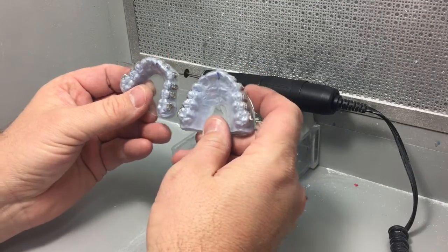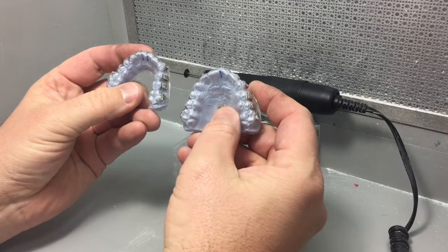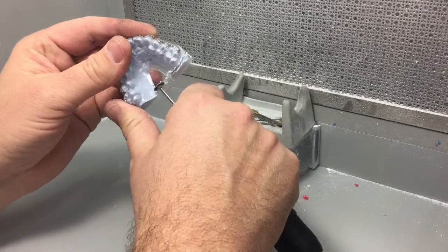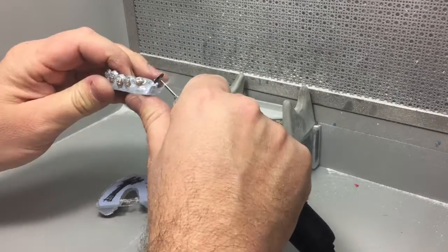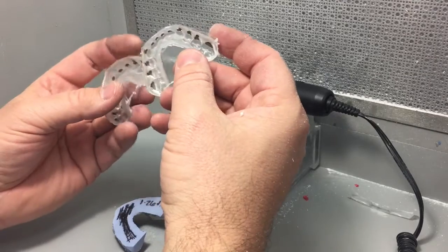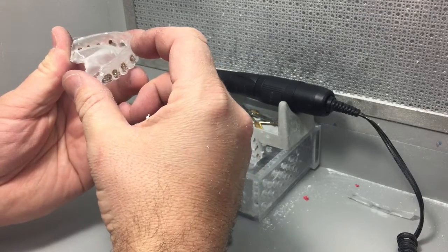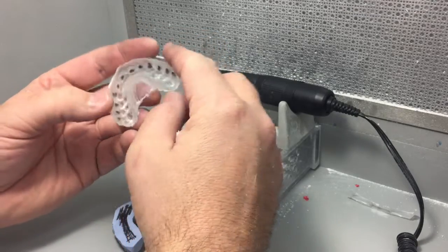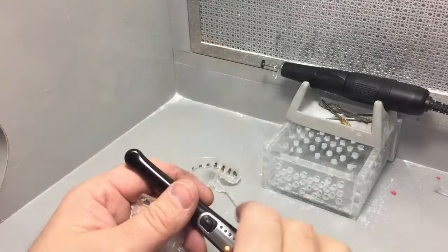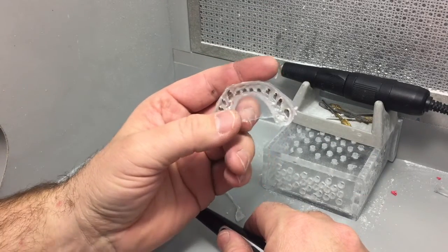It's been about an hour and these models have soaked. Now we're going to remove the Essex tray from the model. We need to re-cure those brackets again to make sure any bond that was not cured through the initial curing process is 100% cured. Now that we have the tray off the model, we're going to re-cure the brackets directly.